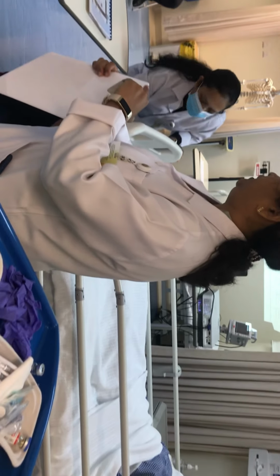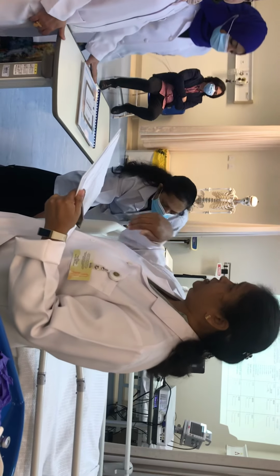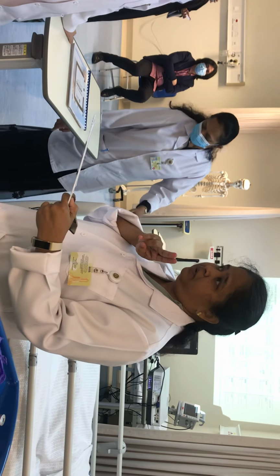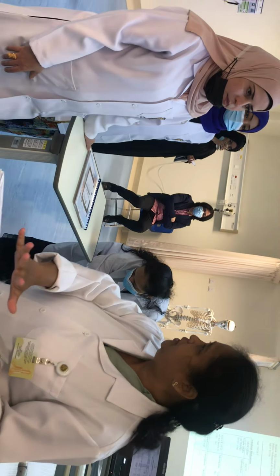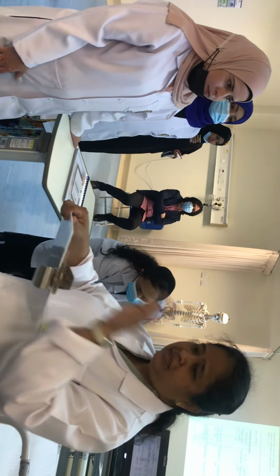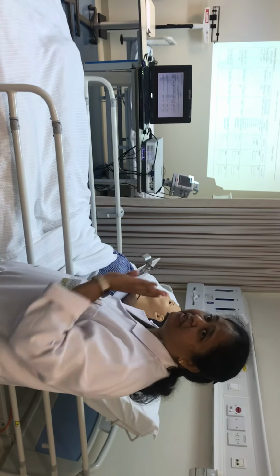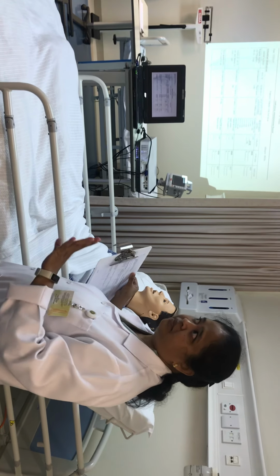From this step, I need a second nurse. My second nurse will check with me. First check here. It is going to be different for subcutaneous and IM. For IM injection, all 3 checks will be done here and everything is prepared. But for subcutaneous, only the first check is done over here. Then second, third, everything at the bedside. So the second nurse is also there with you throughout. You are getting my point? There is a difference over here.